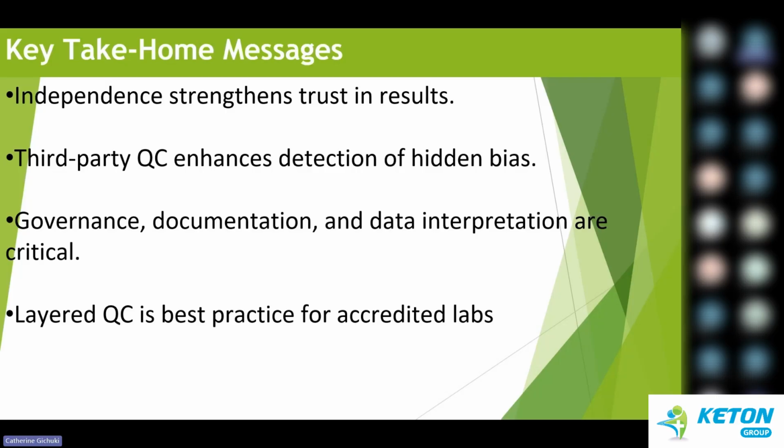That is only when QC becomes good. And then we've talked also, we want to take home layered QC, which is a best practice for accredited labs. Using both the manufacturer's QCs and third-party QC together is a recommended approach, yes, for all labs.